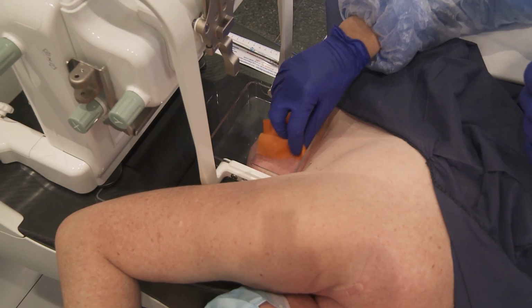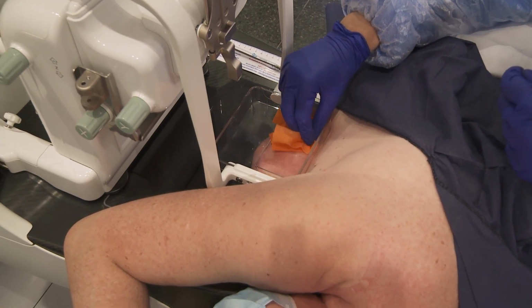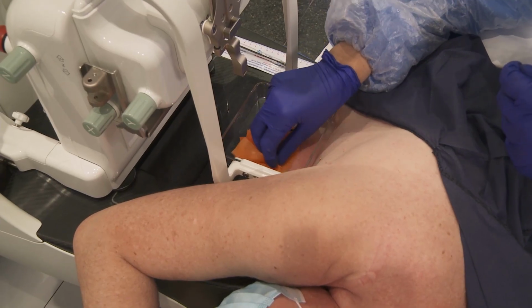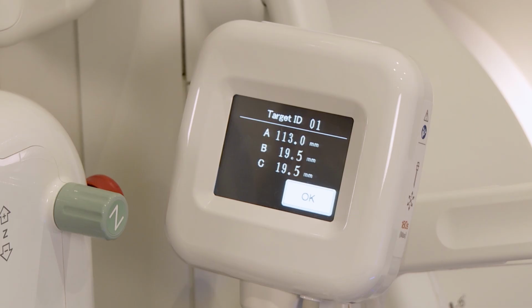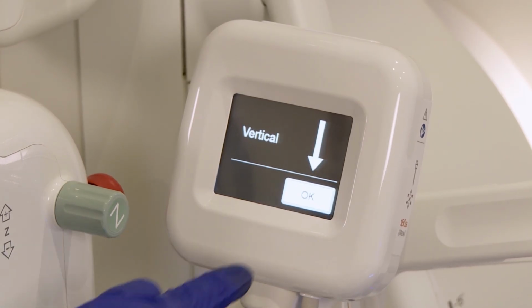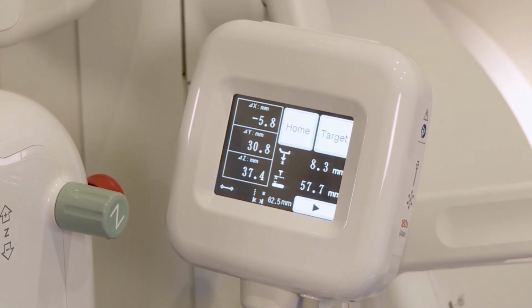Select the EnCor 113 full notch 10G needle and confirm needle values. Click the Send button to send coordinates and needle characteristics to the biopsy positioner. Proceed with skin disinfection. The operation panel shows the target ID and needle characteristics. Press OK to confirm. Press OK to confirm vertical approach.